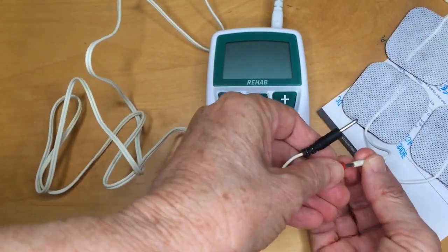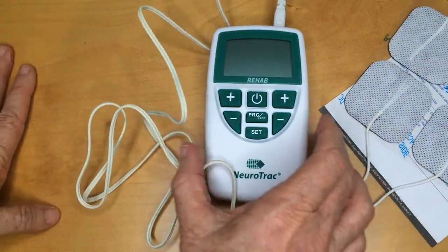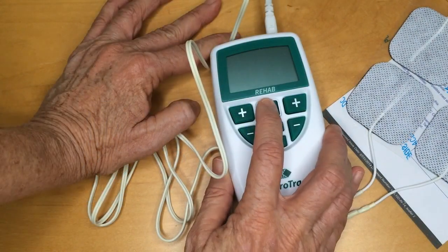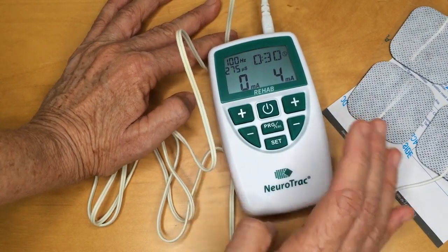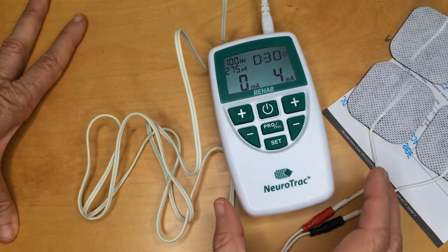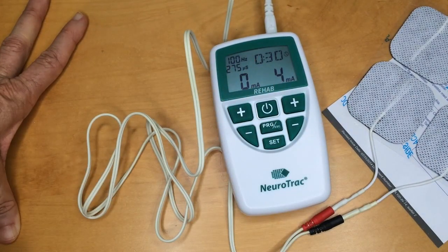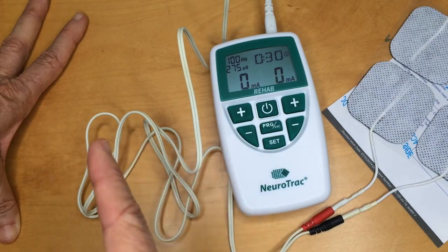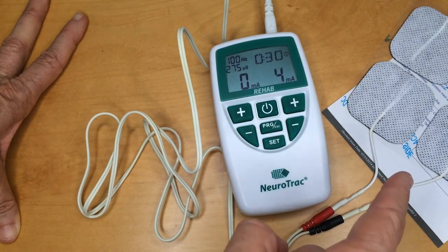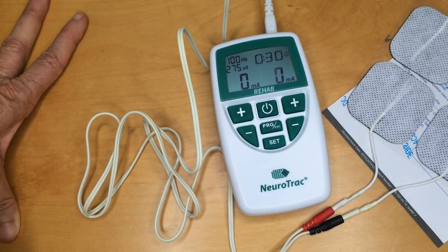I'm not actually going to put the electrodes on because this isn't a clinical video. But just for completeness, I'm going to switch it on so you can see the cycles running. Turn the device on — you can see it's on zero milliamps. Increase the milliamps. Now it will only go to four because I haven't got it attached to somebody; if I had it attached to myself or somebody else it would go up to 20 or 30 or whatever. You can see it went up to four and now it's going down again, then it will go up — it's cycling through the settings we put in: the work, the rest, the ramp up, the ramp down.